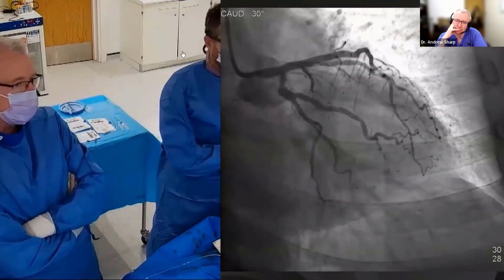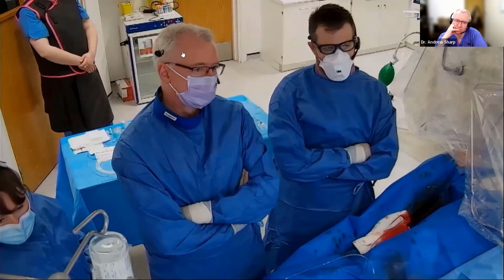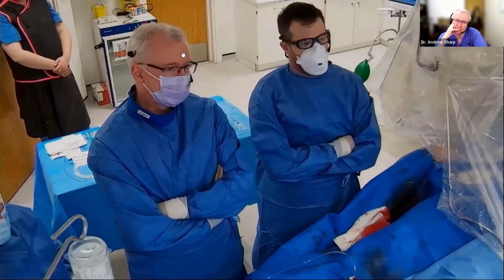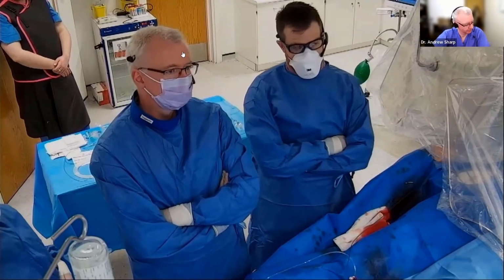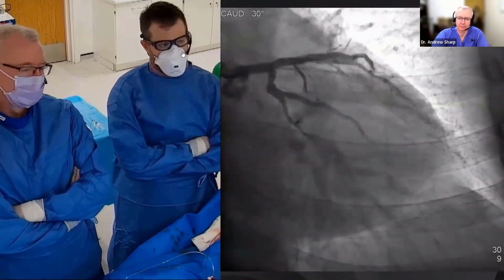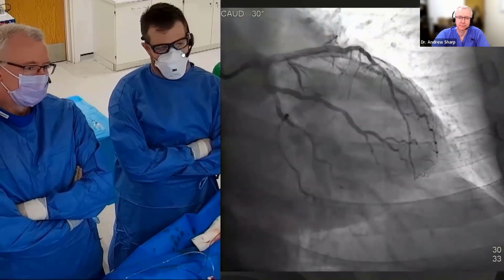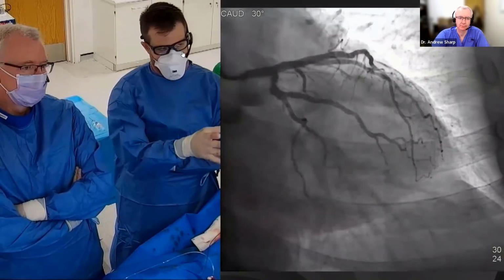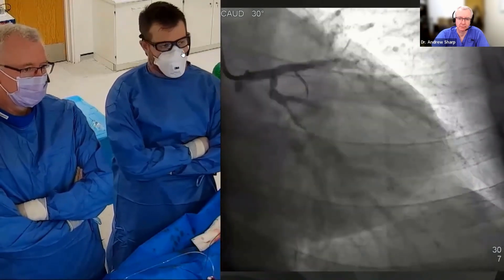Okay, Sean, that's beautiful. Summing up from your point of view? I think it's a great step. But when I looked at the angiograms, I would have been looking to stent much further. Actually, we've kept our stent relatively short. I didn't expect it to be quite as much calcium. It would have been very, very easy to put a longer underexpanded stent into this vessel, and that would have led to poor outcomes. So I think we've done the best job we can in a diabetic who's going to have a high stent failure rate, so we have to do the best job we can.